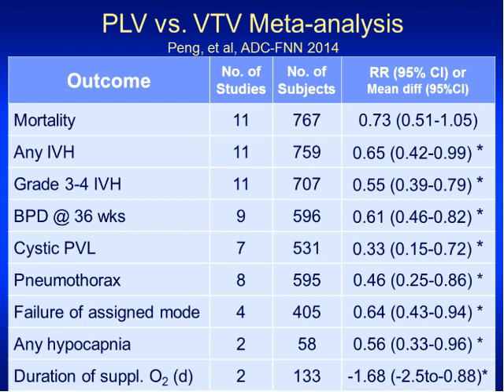So in fact, there have now been 2 large meta-analyses of a bunch of studies that have been published with various forms of volume-targeted ventilation. Most of the outcomes clearly favor volume-targeted ventilation. So this is not just volume guarantee. This included studies using other modalities of volume-targeted ventilation, to be clear. But there's a total of 11 studies included in this latest meta-analysis, upward of 750 infants.